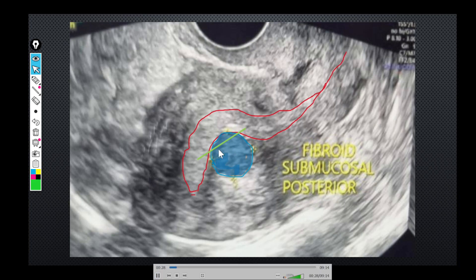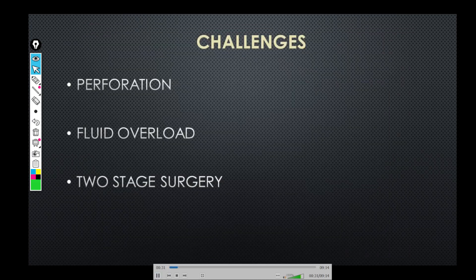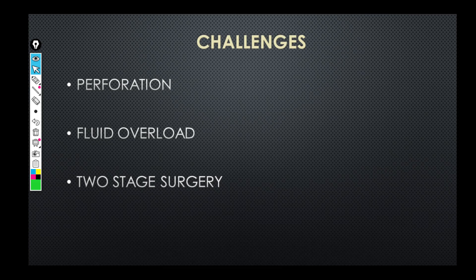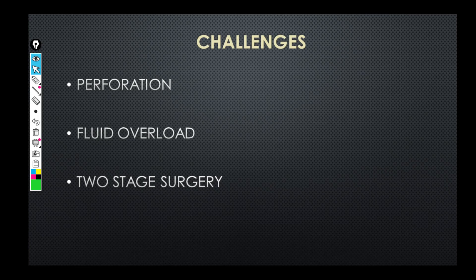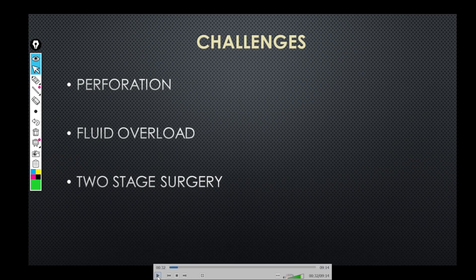This brings us to the challenges of this case. The first is perforation — if you scoop out too much of the myoma you are going to perforate. The second is fluid overload; if you take a long time to perform the surgery the patient will land up with fluid overload, because the depth of penetration of the myoma inside the myometrium is significant and this is predominantly intramural. The last challenge is the possibility of a two-stage surgery, which we want to try and avoid as much as possible.